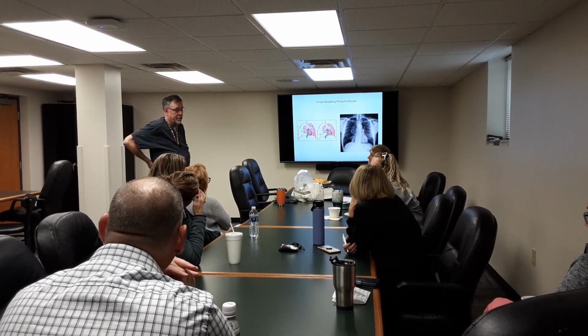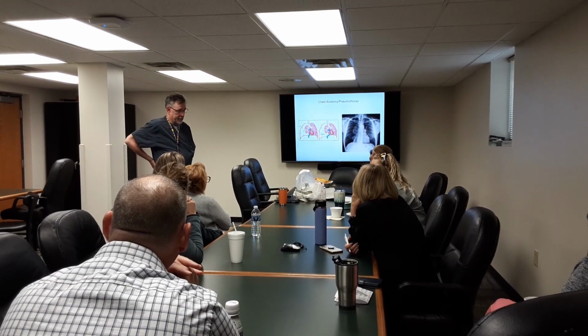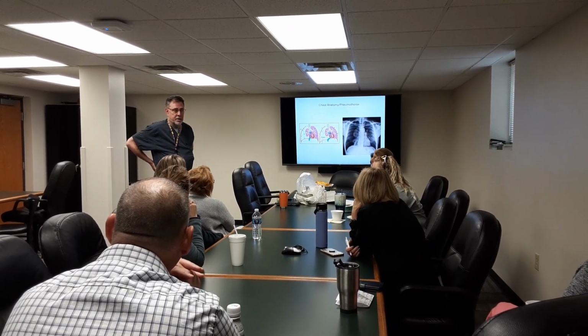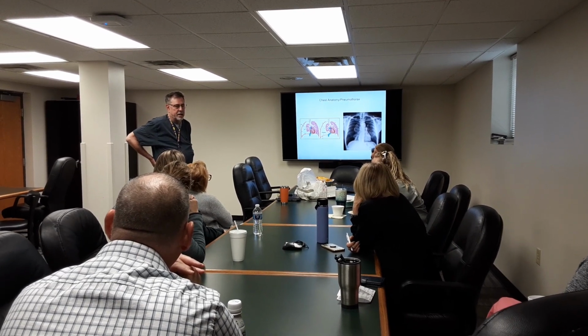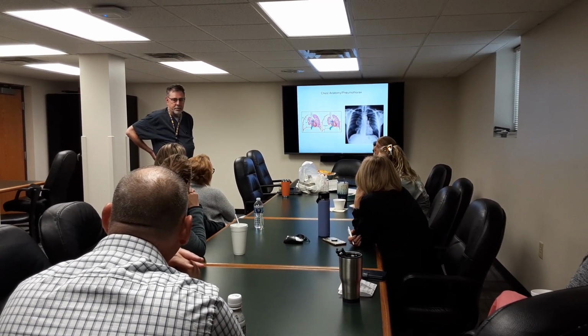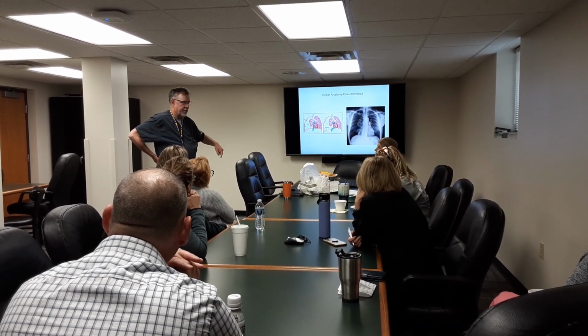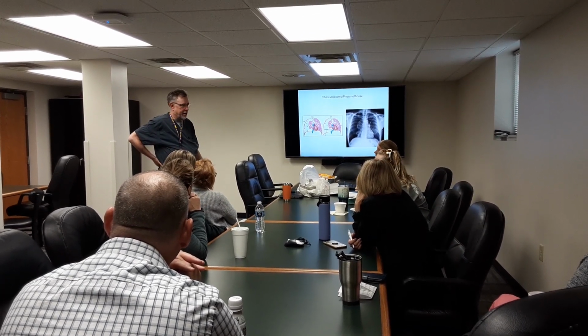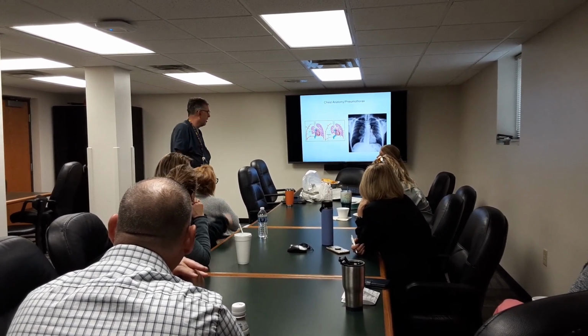In other places around the world, they use what they call a finger thoracostomy. They put your finger in there just to convert, especially if you've intubated somebody, from a tension pneumothorax to a simple pneumothorax. You've actually done them a favor, because with your finger in, the hole is big enough that the air goes in and out, and you're breathing for them anyway, so the lung is expanding.